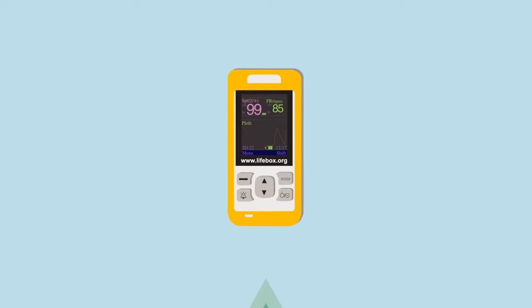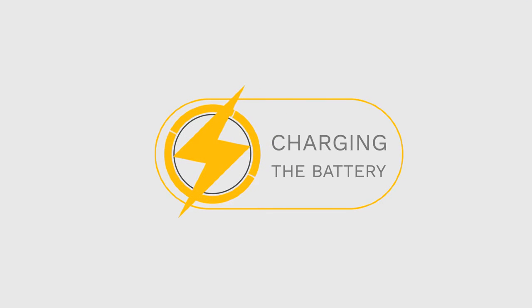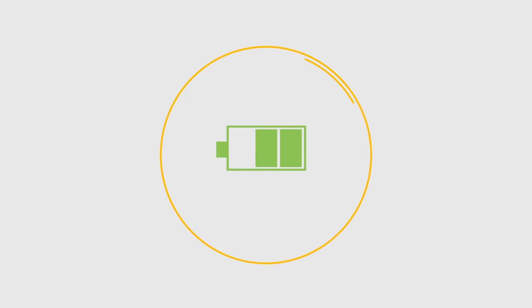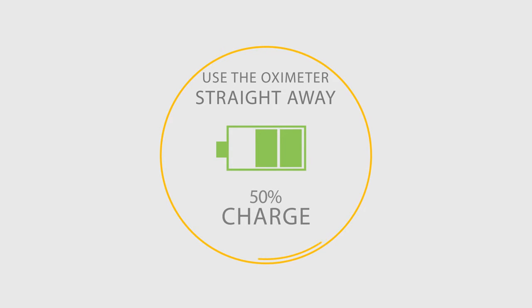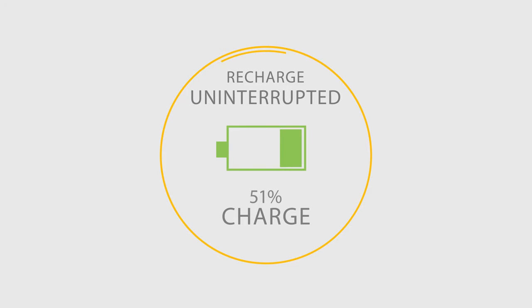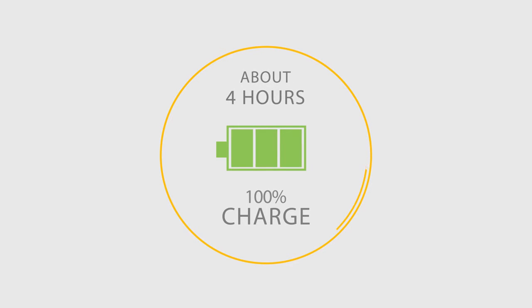The Lifebox oximeter uses a lithium-ion battery, the same as in a mobile phone, and there are certain steps you can take to make the battery last longer. The battery arrives already half charged, so please feel free to use the oximeter straight away. Then recharge the battery uninterrupted until it is fully charged. This will take about 4 hours.